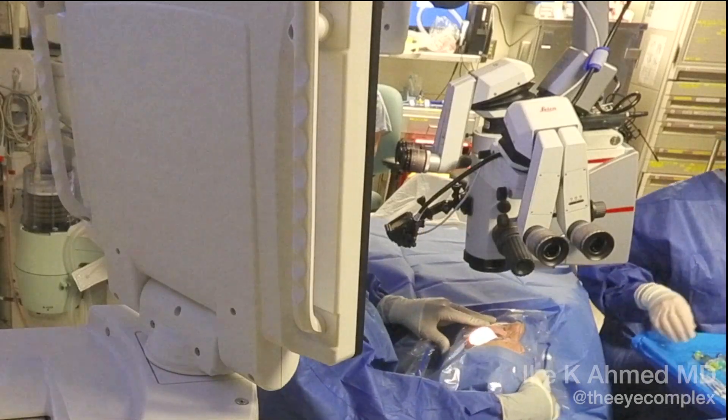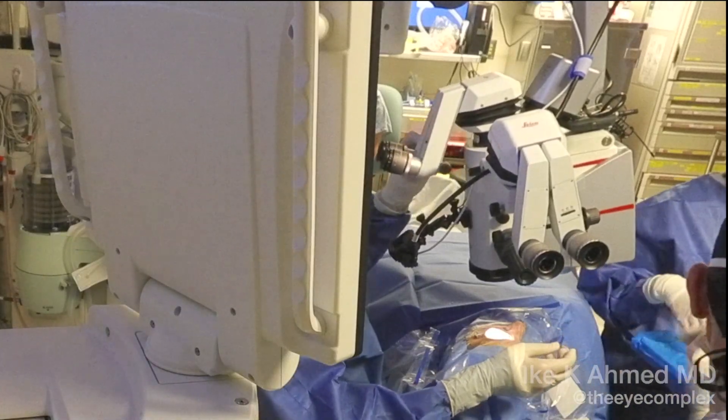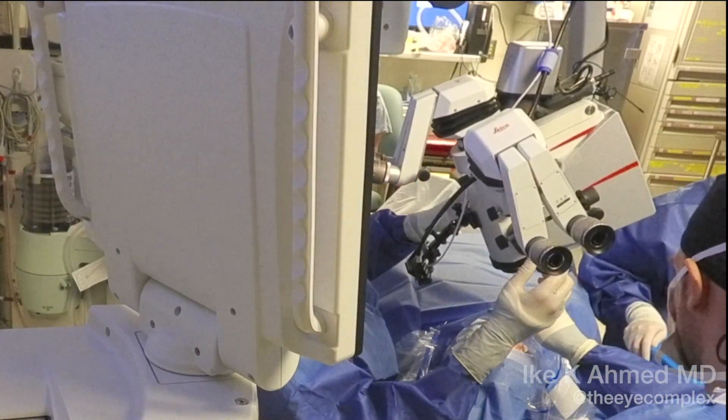This video demonstrates the ELIOS excimer laser trabeculostomy procedure. We start off with the classical MIGS positioning, tilting the patient's head 40 degrees away, and tilting the microscope 40 degrees as well.